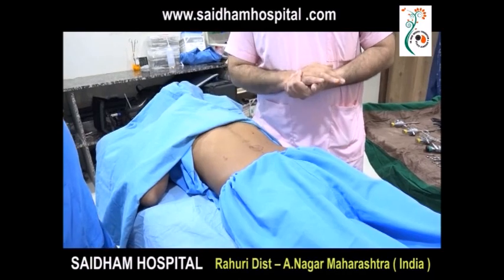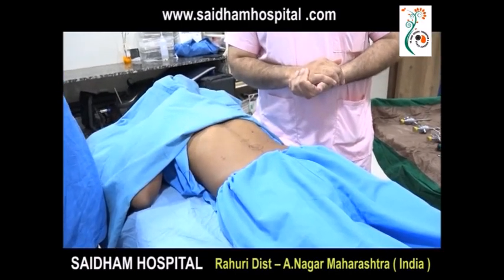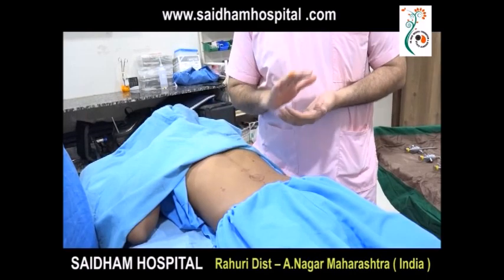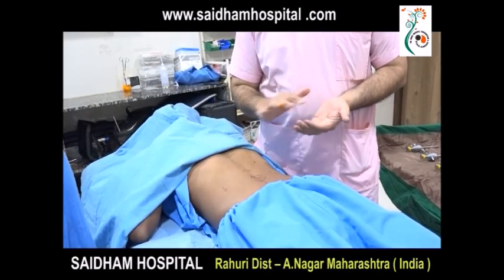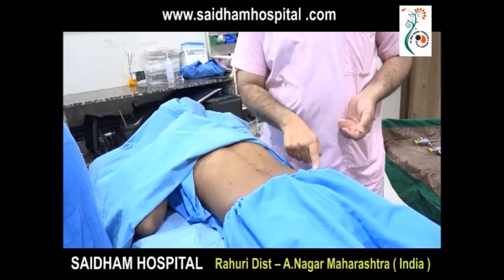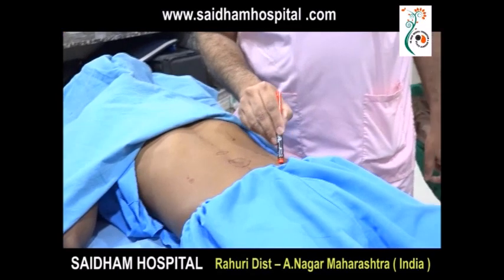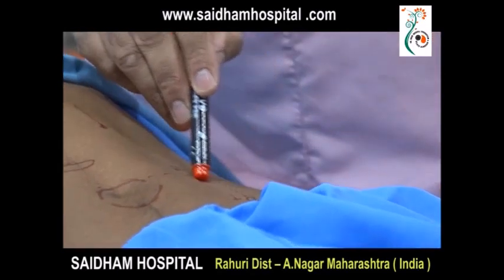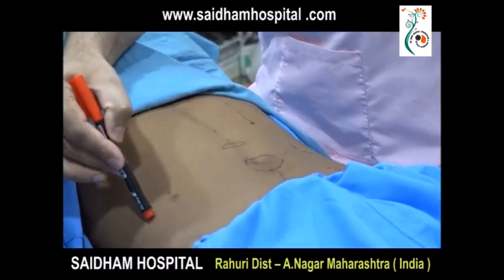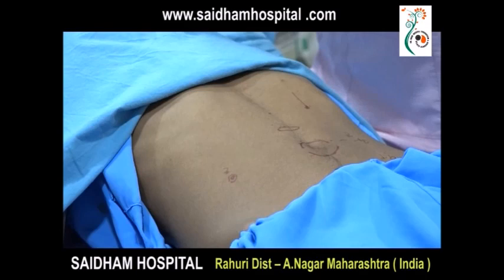These four entry points are sufficient for all gynecologic endoscopic surgeries — cystectomy, tuberplasty, tuboplasty, Wertheim's hysterectomy, tubal ligation. We have performed approximately 1,600 surgeries over nine years and recommend these four points without confusion. To repeat: the first secondary trocar is two centimeters above and medial to the left ASIS; the second is at the junction of the vertical line through the first trocar and the horizontal line from the umbilicus; the third is four centimeters above the ASIS and one centimeter medial.